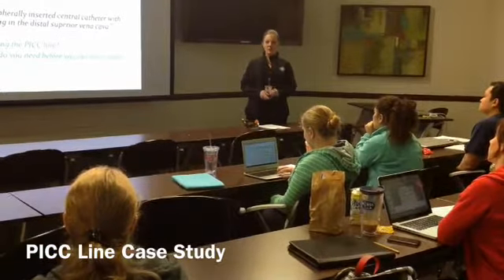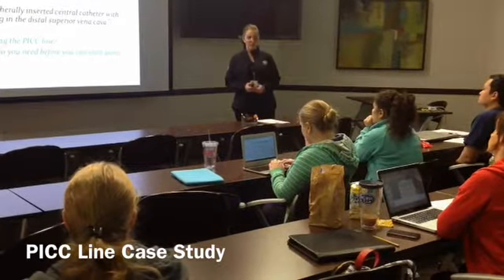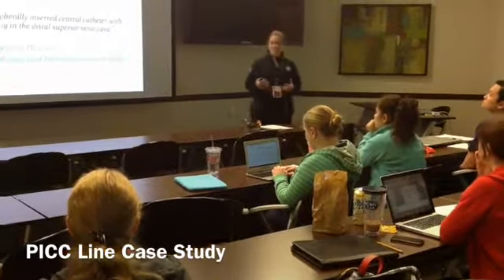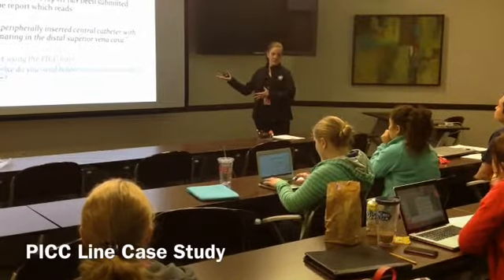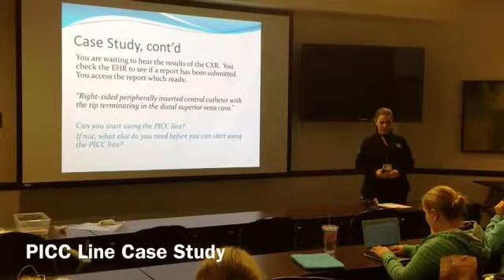You need the doctor, the radiologist, to verify that tip placement. You actually need to hear it from them, okay? So, but you know it's in the right position, correct? You just need to get that clearance from the radiologist. That's his job to read it, right?